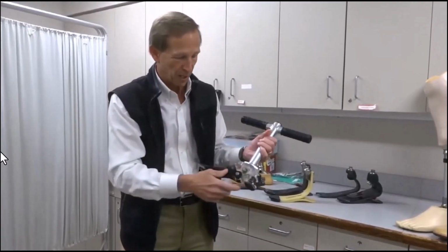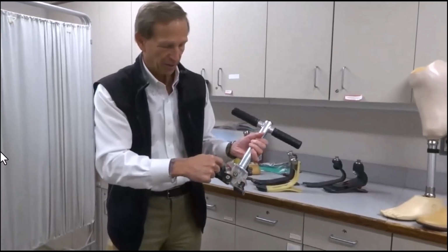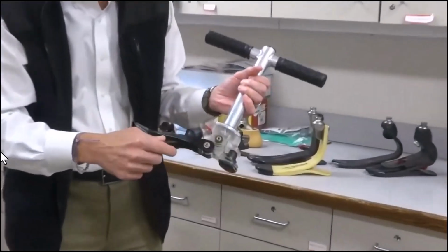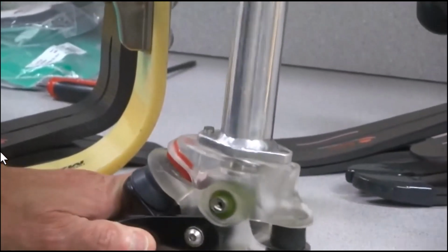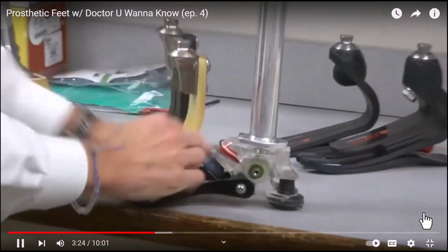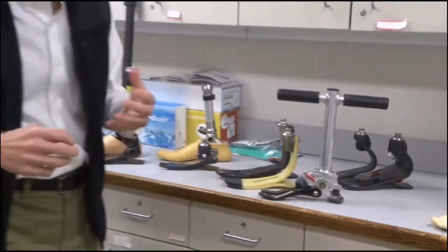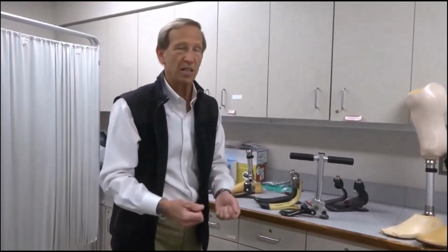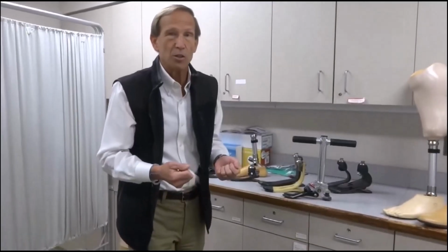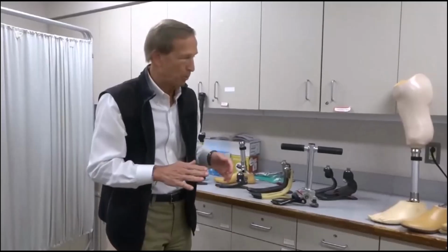This particular foot has multiple rubber bumpers at the heel, here in the front half of the foot, around the ankle joint, to allow motion. That's going to go up and down, tilt a little bit, and even rotate a little bit. And that type of rotation is important for certain activities where you might plant your foot on the ground and twist a little bit. Simple things like tennis or golf. You're not necessarily doing a lot of running or jumping, but that multi-axial movement may be important to you.